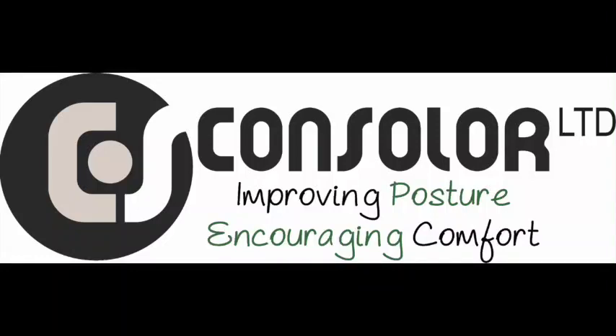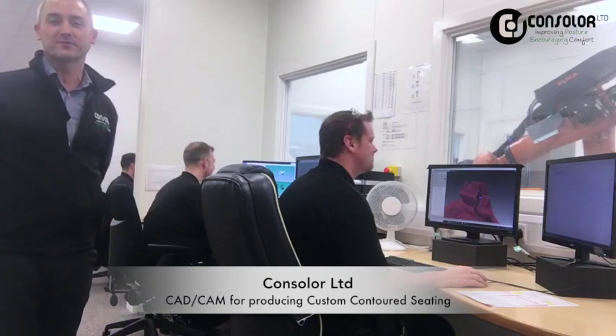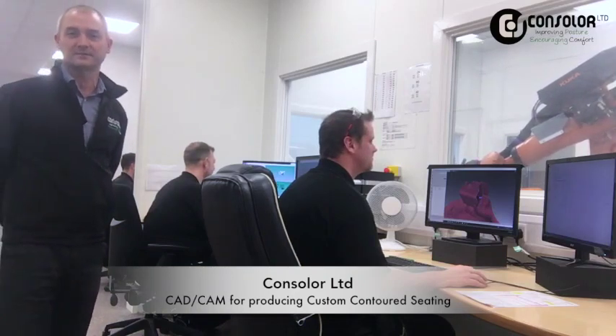Hello, I'm Kyron Shear, Managing Director at Consolor. In this video, we'll show you a quick whiz through of how we manufacture a custom contoured carved foam seating system.